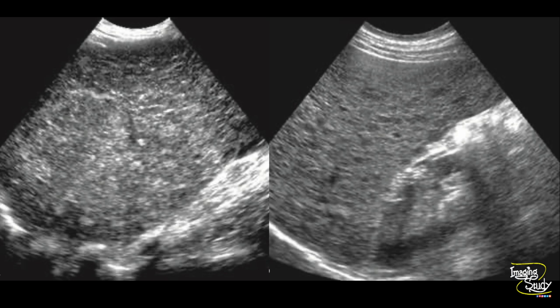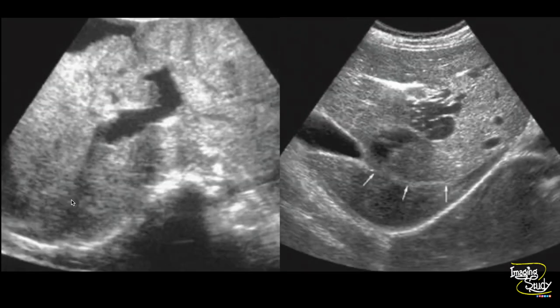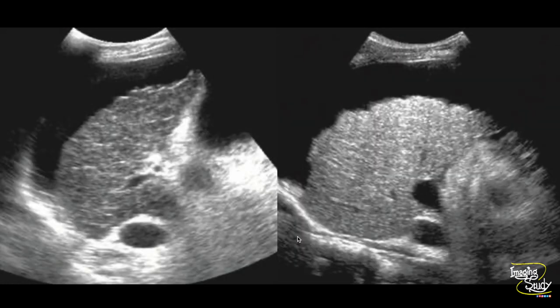Here's a cirrhotic patient showing the coarse parenchyma and innumerable tiny hyperechoic nodules. This one showing the coarse parenchyma and innumerable tiny hypoechoic nodules. Again, you can see the surface nodularity and the coarse hepatic parenchyma. Here on this sagittal image, you can see the enlarged caudate lobe. This transverse ultrasound shows the right lobe to be smaller in size with an enlargement of the left lateral segment. On the right image, you can see this is the main lobar fissure. This one is the right lobe and this huge part is the left lobe of the liver. Here you can see some small end-stage livers with surface nodularity and ascites.